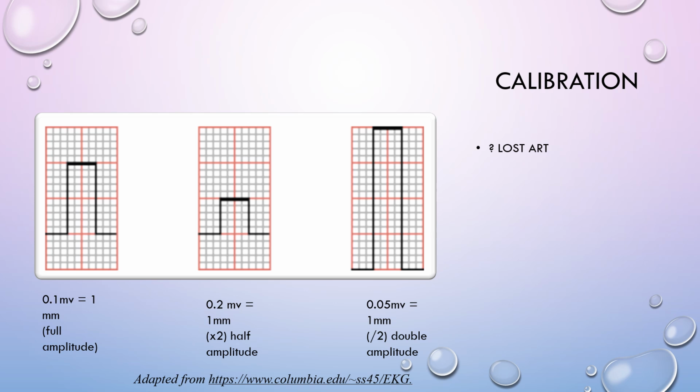However, if we have ventricular hypertrophy, for instance, and the waves are so high up and they are getting into each other, and we don't know where one starts and where the other one stops, the technician may do a half calibration, and that reduces everything in the vertical axis by half. So if you count anything in that vertical axis when there's a half calibration or a half amplitude, you have to multiply that by 2 to get the real amplitude of that chamber.